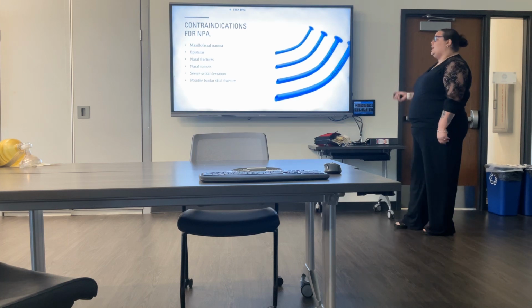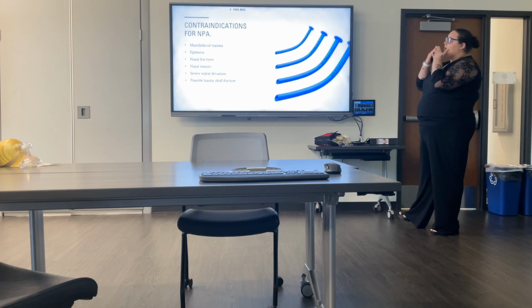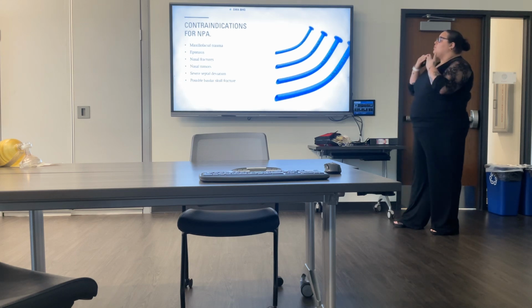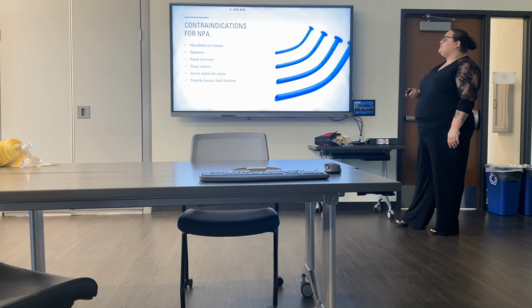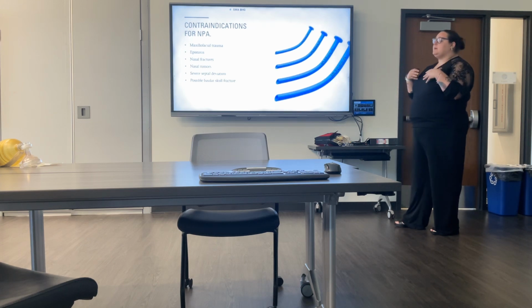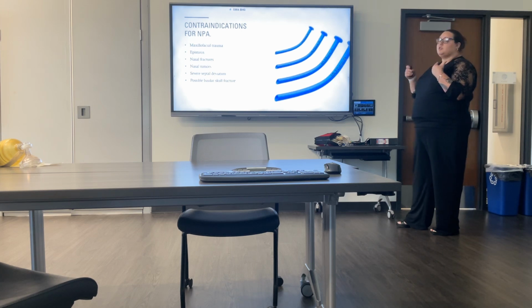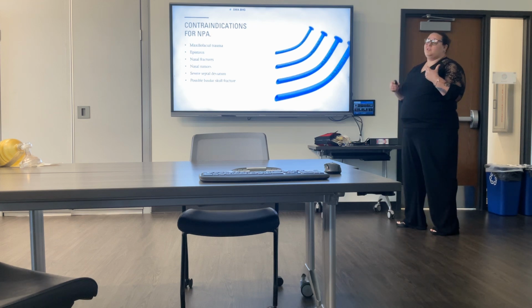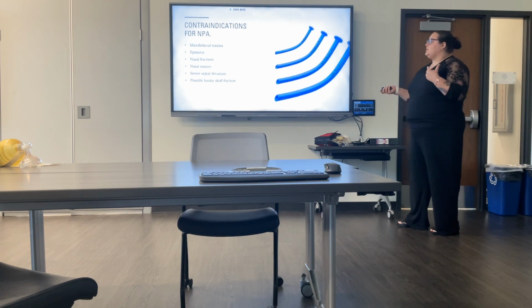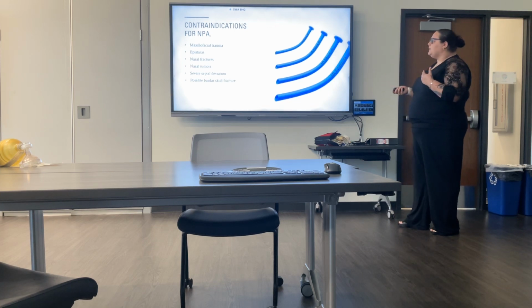Some of the reasons we do not want to place an NPA: we have maxillofacial trauma. Facial trauma of the maxilla, the nasal bones like the lacrimal bone and some of the jawbone, you may not want to place an NPA. They typically have loose bone fragments, extreme bleeding behind there, and in the soft tissues you risk puncturing more soft tissue, causing more trauma and more bleeding, and you can also actually puncture their brain with it. Even though it's hollow and rubber, when you're putting in enough force, you can cause more trauma.